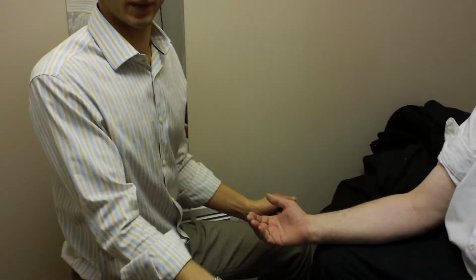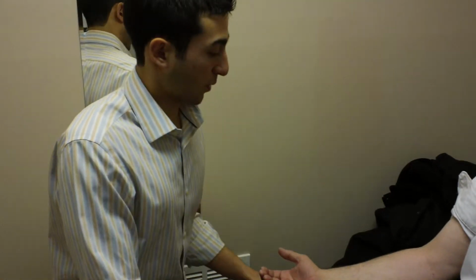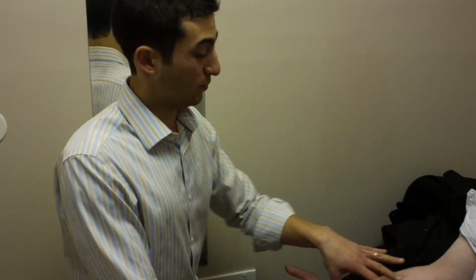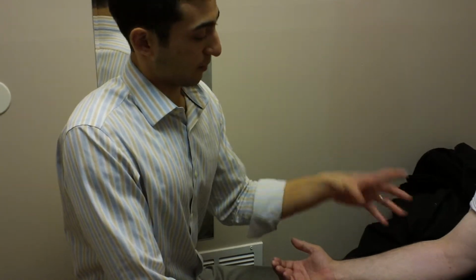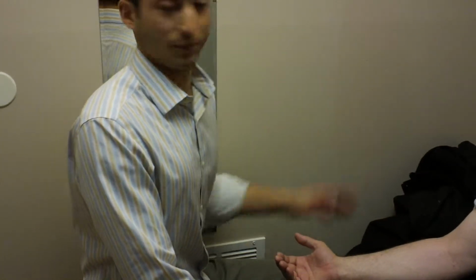Okay. Today we're going to show you how we can use Kinesio Tape to help someone with a musculoskeletal problem in their upper extremity. So we have our patient here today who's presenting with pain with elbow extension and with extension of the wrist, as well as pronation of the wrist. We're going to use Kinesio Tape on two muscles that are very active and overworked, to help calm the muscles down and keep them from over-contracting.